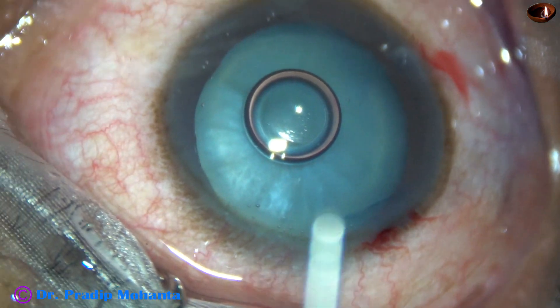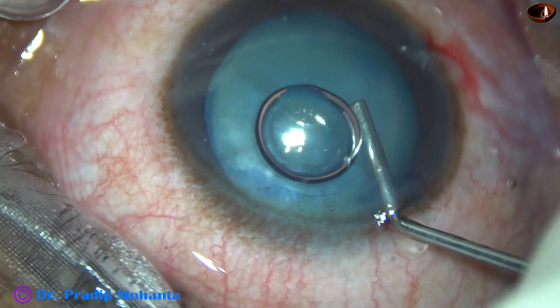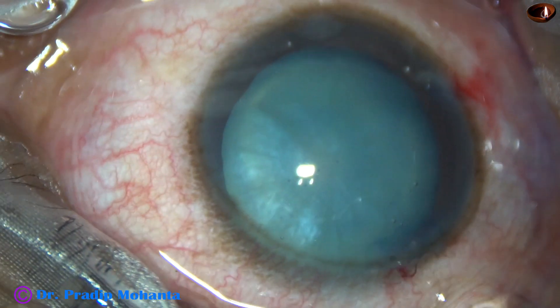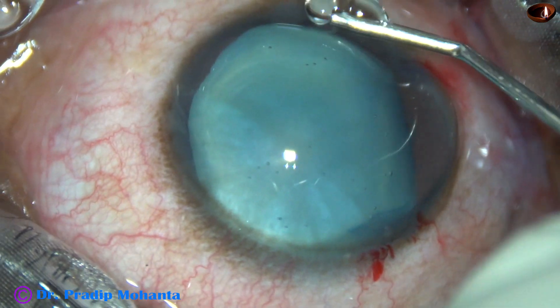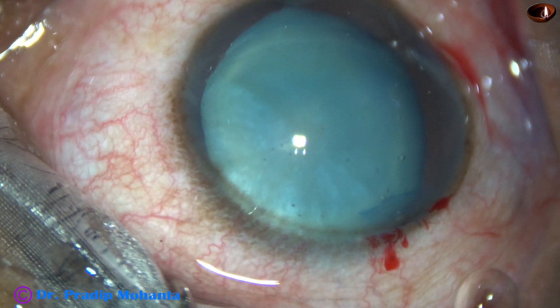The anterior chamber is filled up with 2% hydroxypropylmethylcellulose. I do not use sodium hyaluronate in these white cataracts, not even in intumescent cataracts.